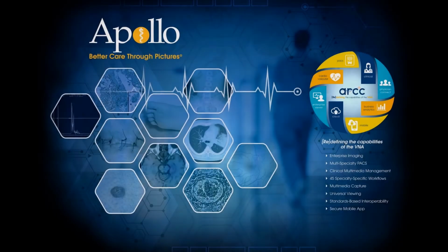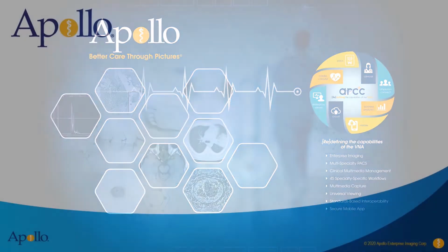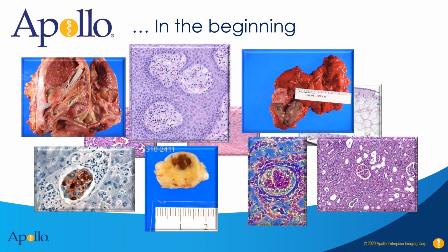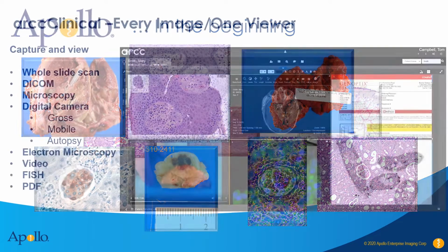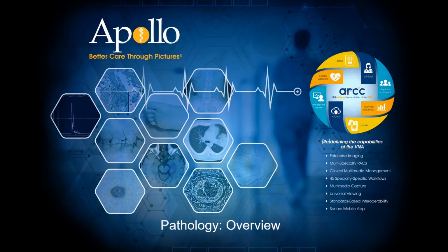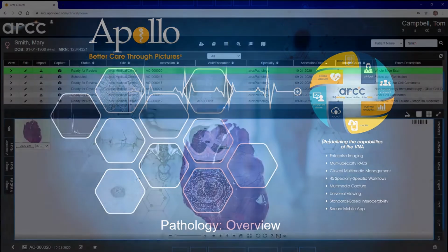Apollo Enterprise Imaging was founded 27 years ago to take on the challenge of helping the pathology department in digital transformation. Apollo is now an industry leader in enterprise imaging, addressing departmental workflows and creating a central archive and single viewer for all images across the healthcare spectrum, no matter the image format or what department created them. In this video, we take a look at how Apollo Arc can be used in pathology.